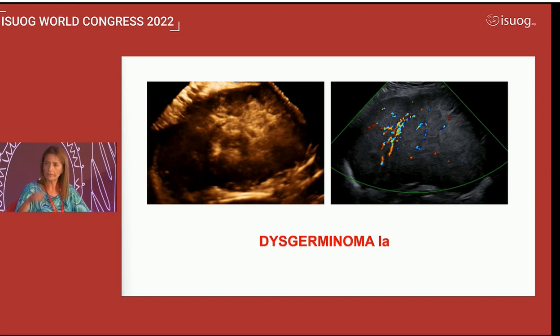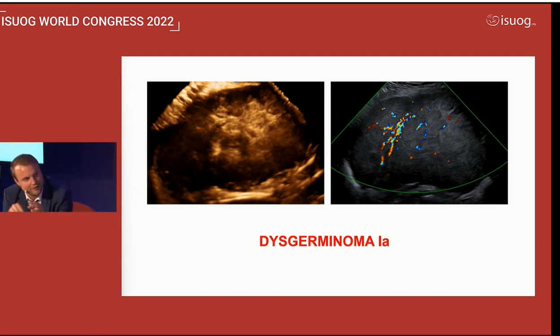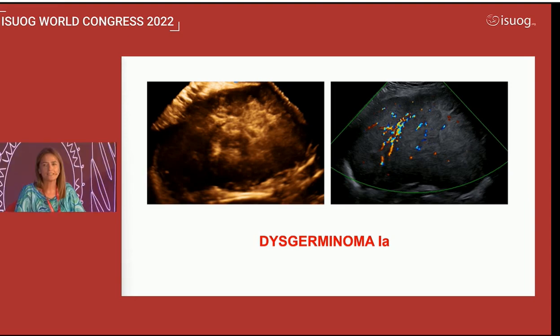So you mean that there are more hypoechogenic round structures surrounded by hyperechogenic septa? Or how do you describe it? I didn't notice that. Only lobulated so far. We needed to collect the round structures inside.